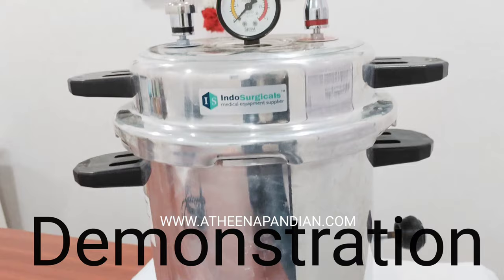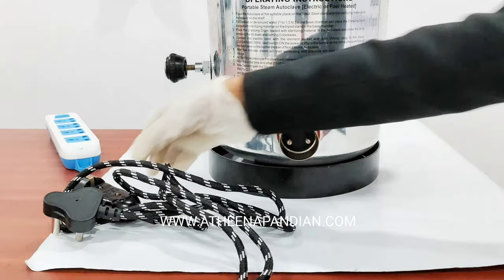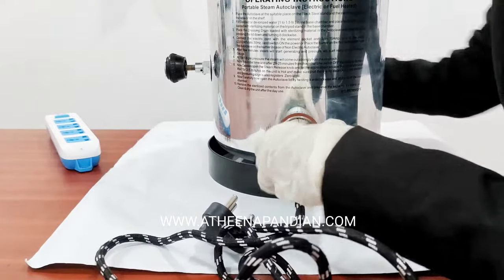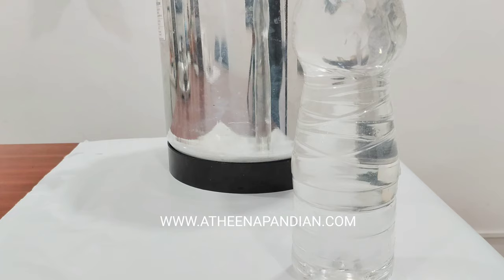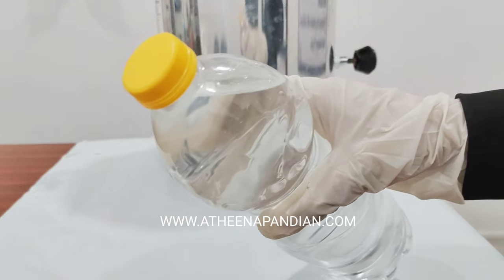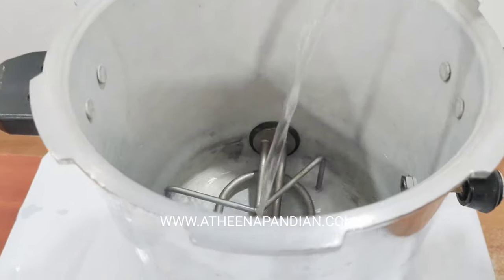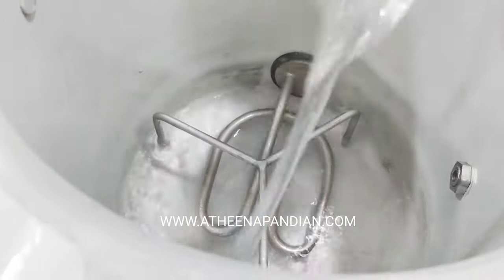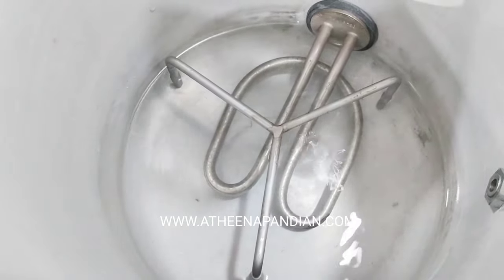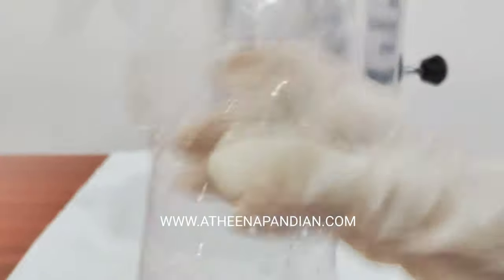Till this we have seen the parts of the autoclave. Now we are going to demonstrate the working process of the autoclave. I am going to connect the power cord to the machine. Now I am going to pour water of about 1 liter. You can see this can which has a capacity of 1 liter. I am going to pour this water completely into my autoclave.